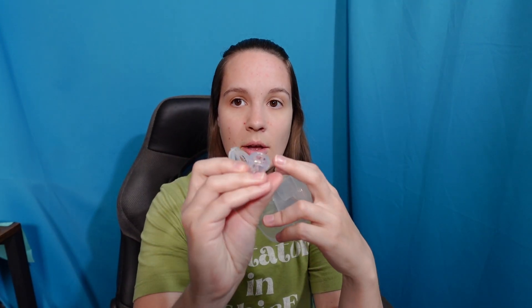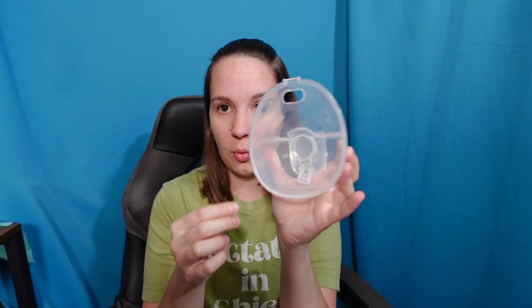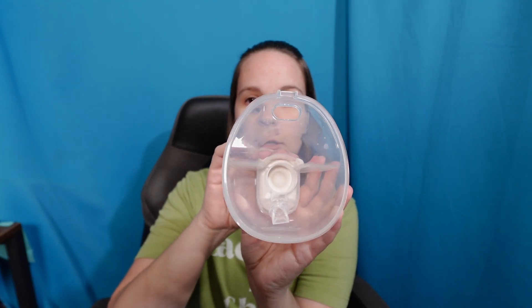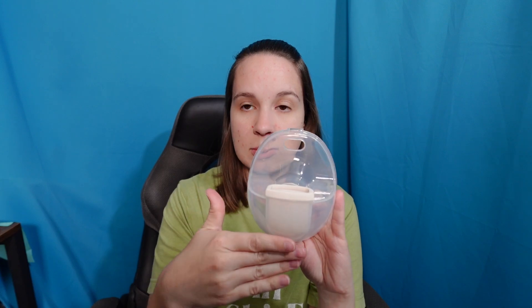Starting with the bowl, it's got the little duck bill. You can see on the duck bill there is a lip in here — like many other models, you just line it up all the way and pop it in. If it's a little cockeyed you can straighten it out afterwards. For the backflow protector, it's got this little notch that needs to face the duck bill. It has a little curve designed to perfectly fit over it, so line that up with the smooth side to the back.